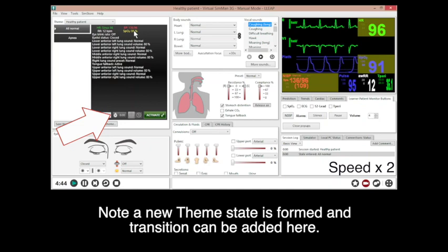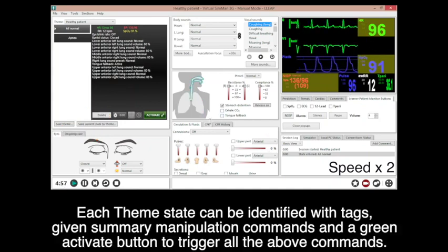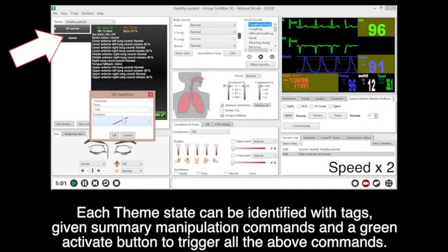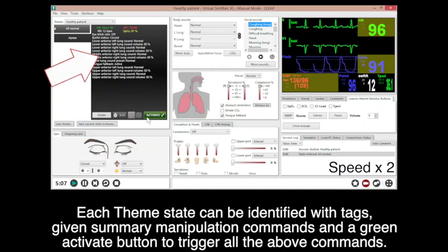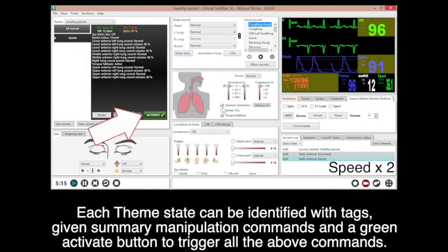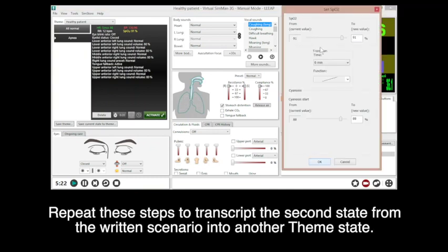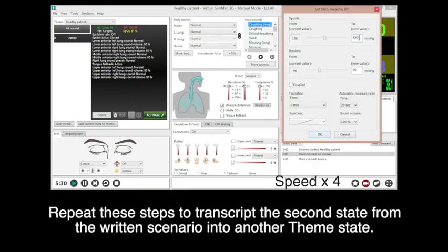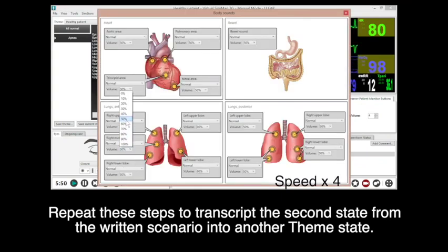Note that a new theme state is formed and transitions can be added here. Each theme state can be identified with a tag, a summary of commands, and a green activate button to trigger all the above commands. Repeat these steps to transcribe the second state from the written scenario into another theme state.